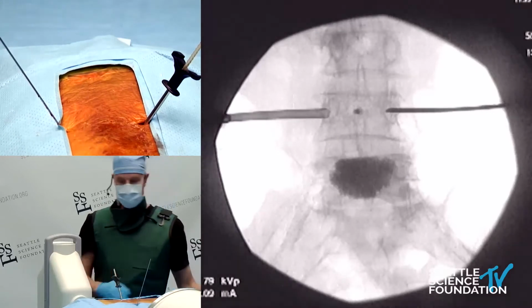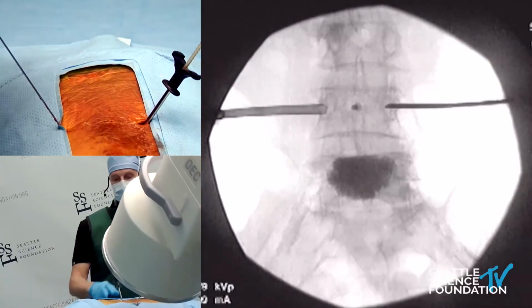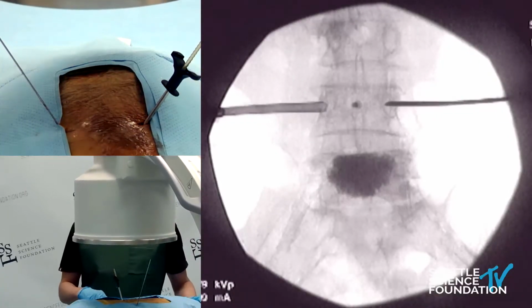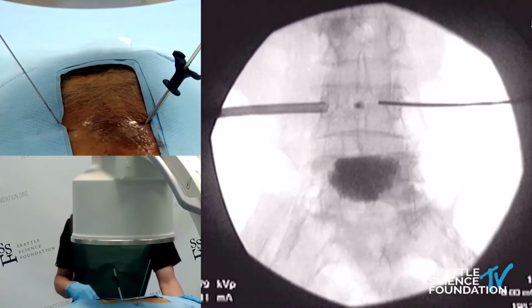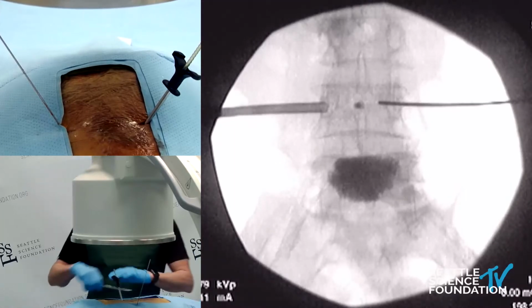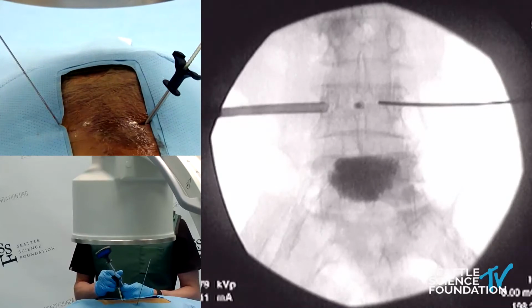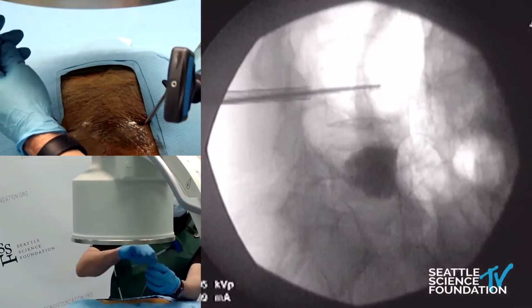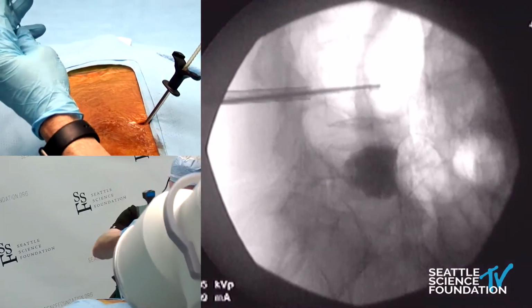And I would suspect the K-wire tip would be a little bit more ipsilateral than the contralateral side that we just accessed and plugged with the acrylic plunger. So what we'll do with the reamer is we'll try to medialize this a little bit. This is an additional tip and trick that you can do. So let's save that and let's go back lateral. And so the reamer goes over the top of this.